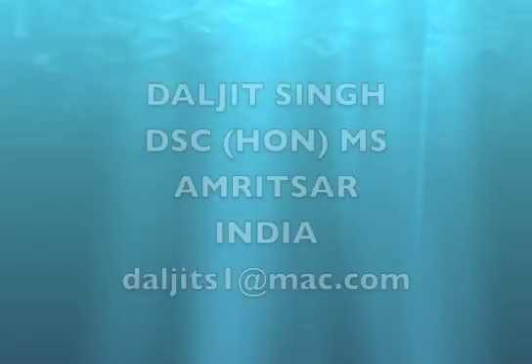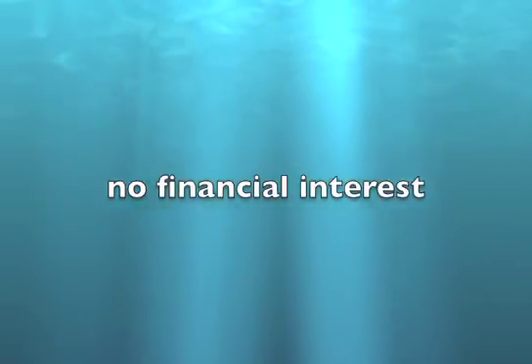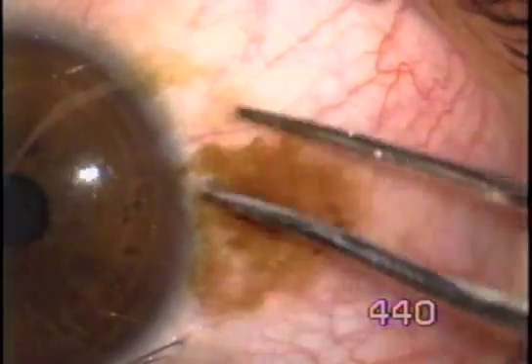Erasing a conjunctival nevus with fugoblade. This is a young patient, 15 years of age, who has an ugly looking nevus.